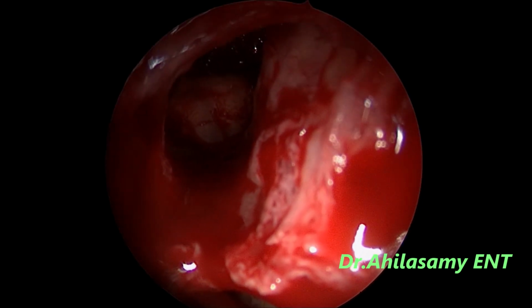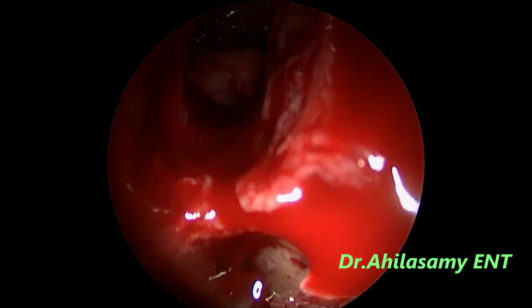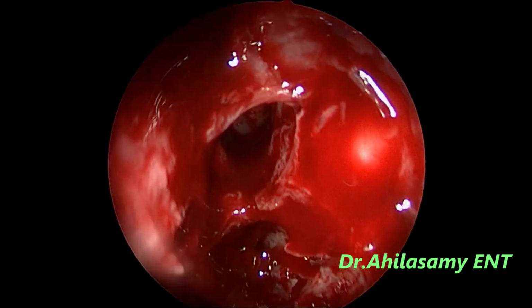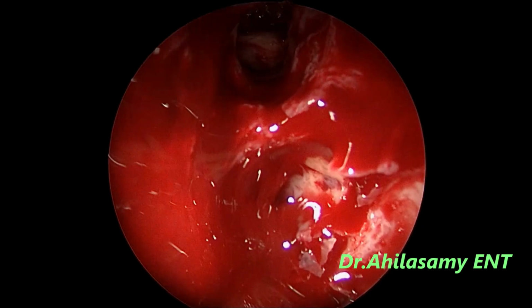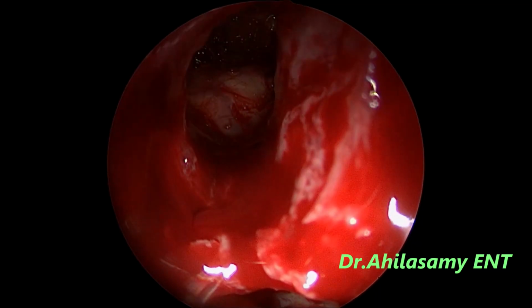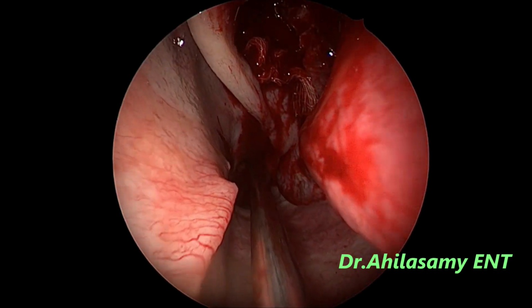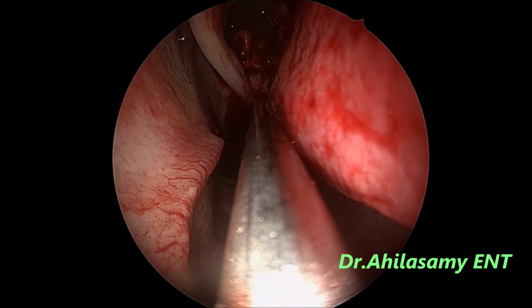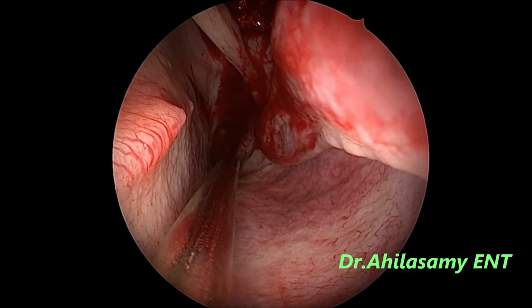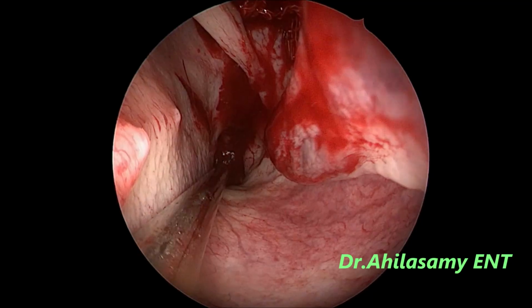A very good view of the frontal sinus, frontal beak, the posterior of the frontal sinus and everything. It's now clear, absolutely clear. Of course, we can't give washes under local anesthesia, otherwise the patient will aspirate. Any blood trickling into the choana, please suck it or ask the patient to swallow. Otherwise, the patient will aspirate and keep coughing and disturb your surgery.